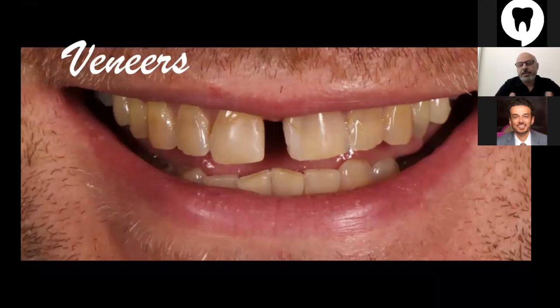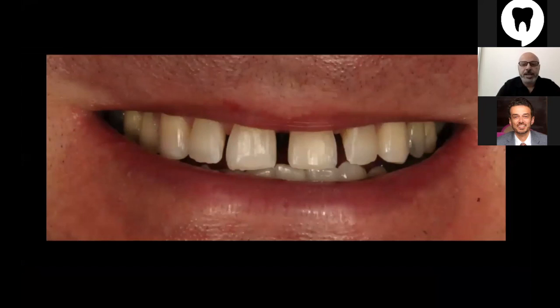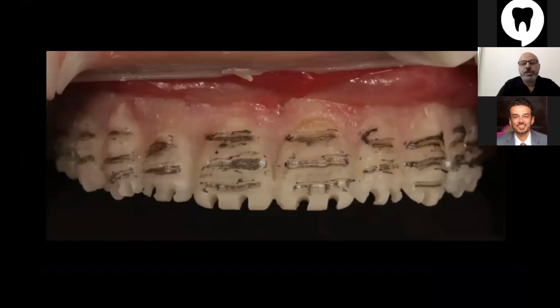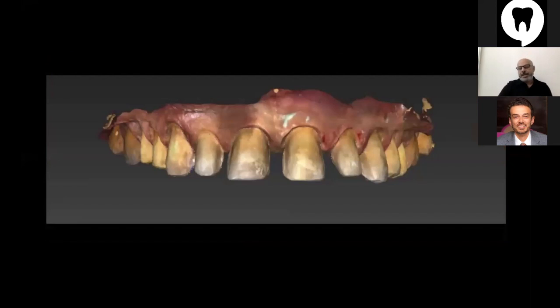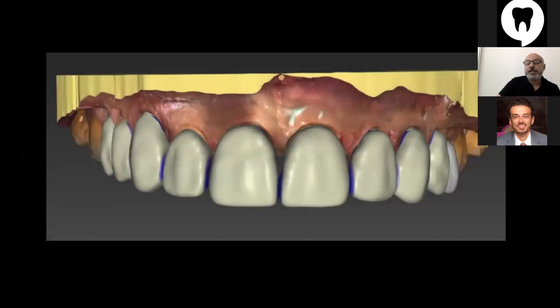Cases like these, if the patient doesn't have any time and you want to finish everything, then you can do everything in the clinic with full designing and preparation, and of course scanning afterwards and doing the whole design on the CAD-CAM. In this picture, it's the in-lab software from CEREC, from Dentsply Sirona, and this is the final design of the veneers.